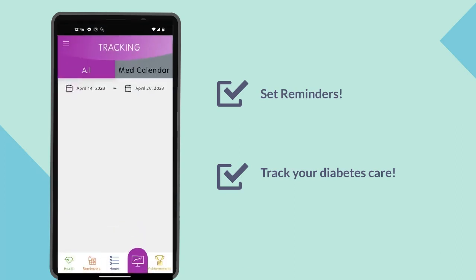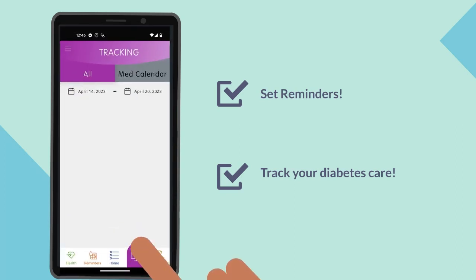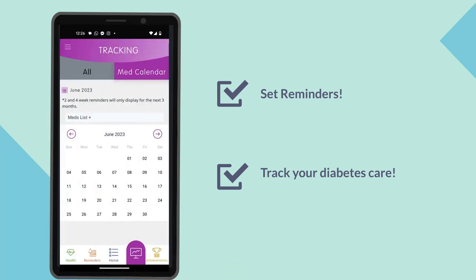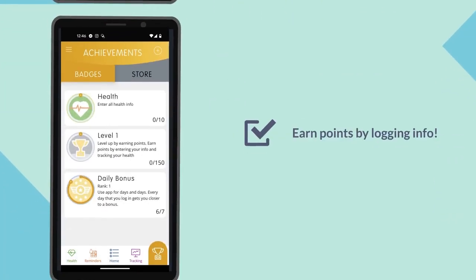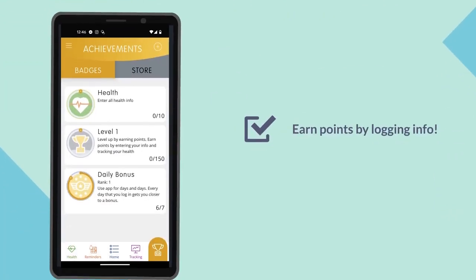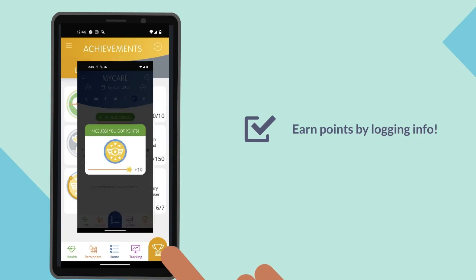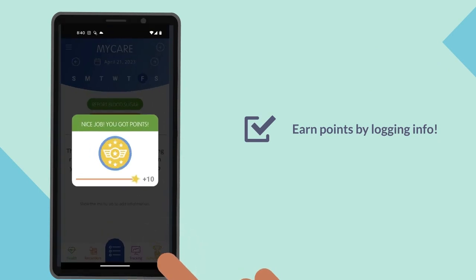By clicking the tracking icon, you can track your diabetes care and management. This is a great way to earn points and earn badges. Reporting your blood sugar and tracking your care earns points, so be sure to log in every day.